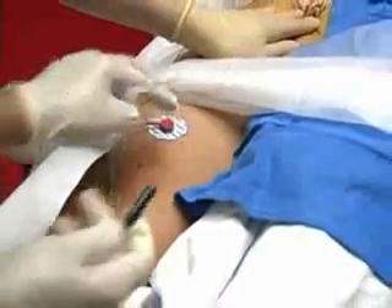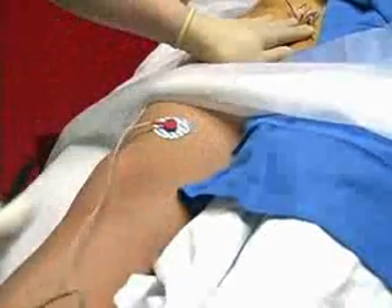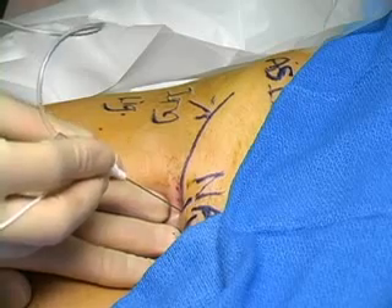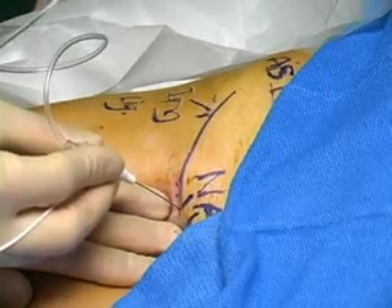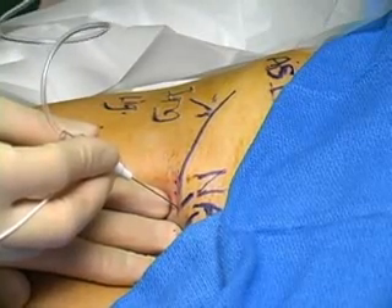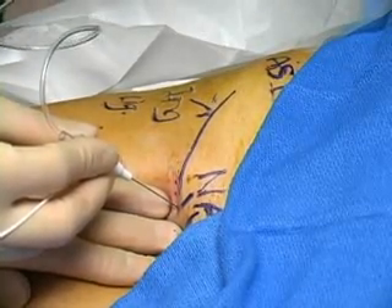Attach the electrode to the skin to complete the circuit with the stimulating needle and the nerve stimulator. Insert the stimulating needle through the skin one centimeter lateral to the femoral artery, slightly below the femoral crease.